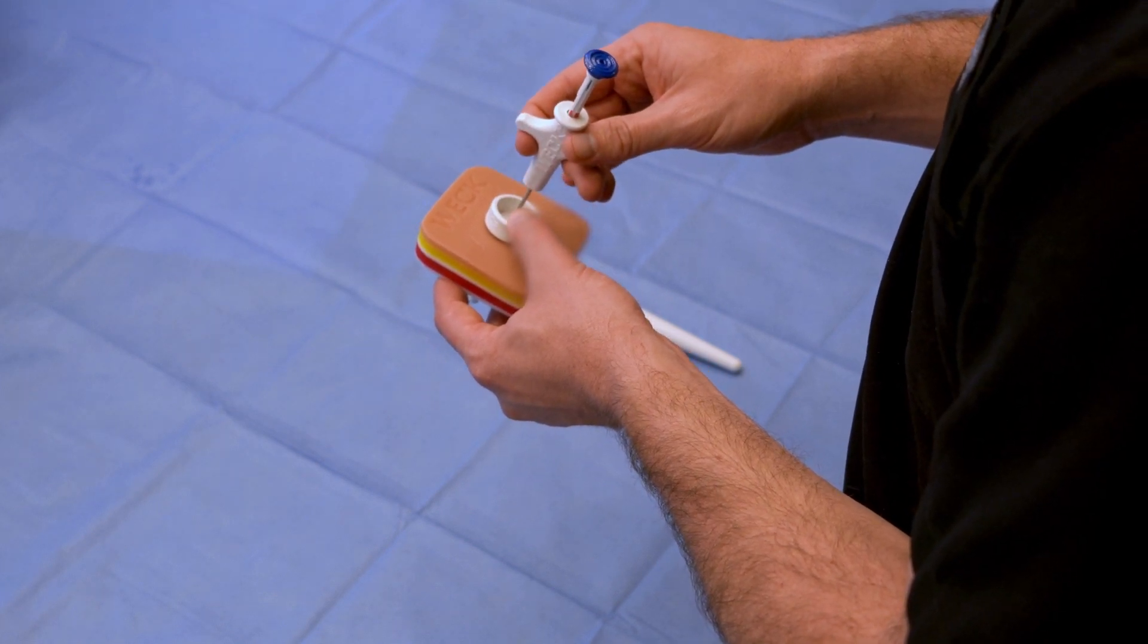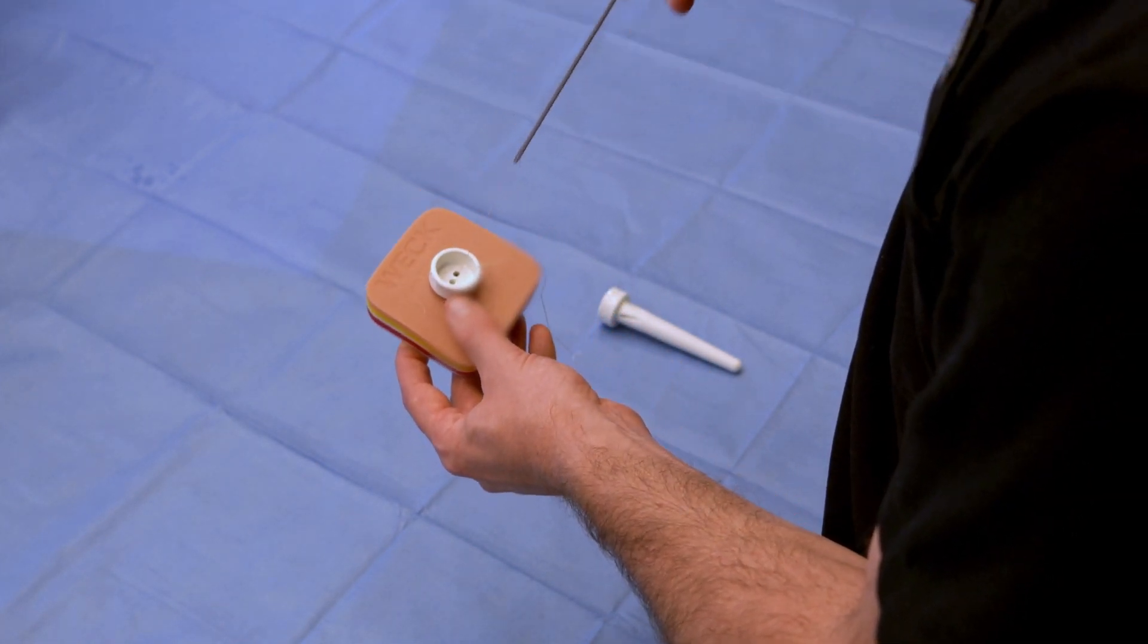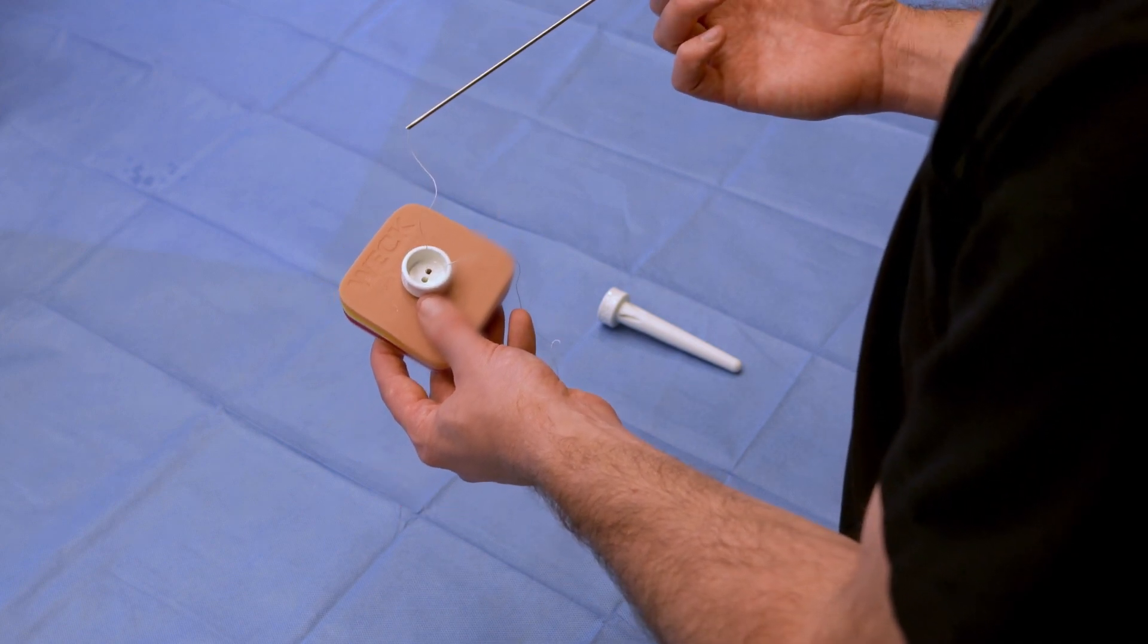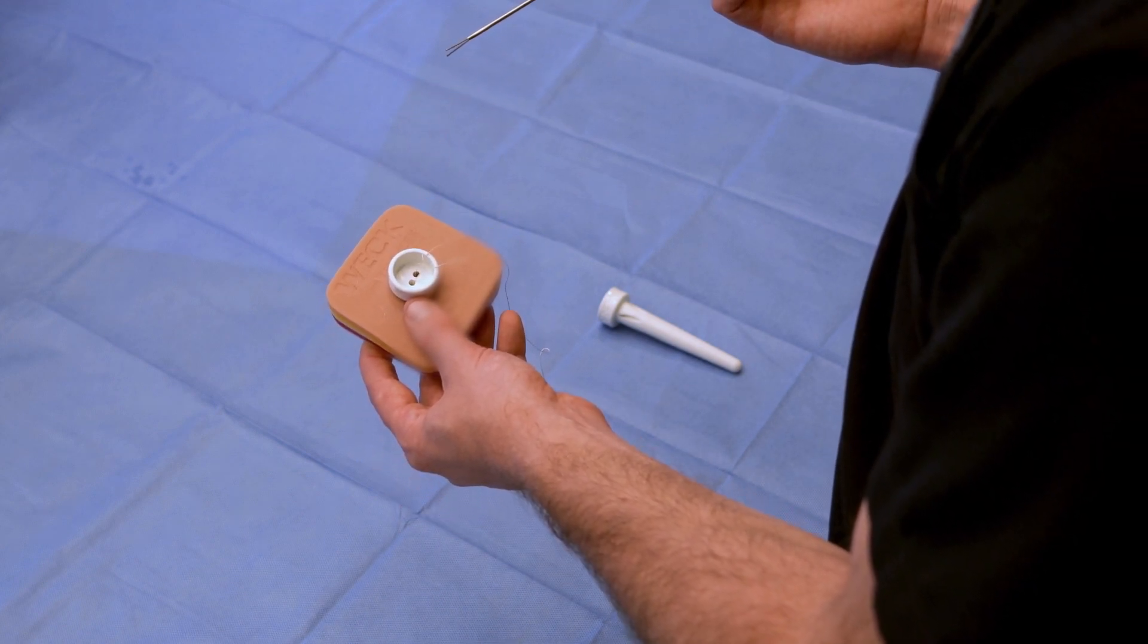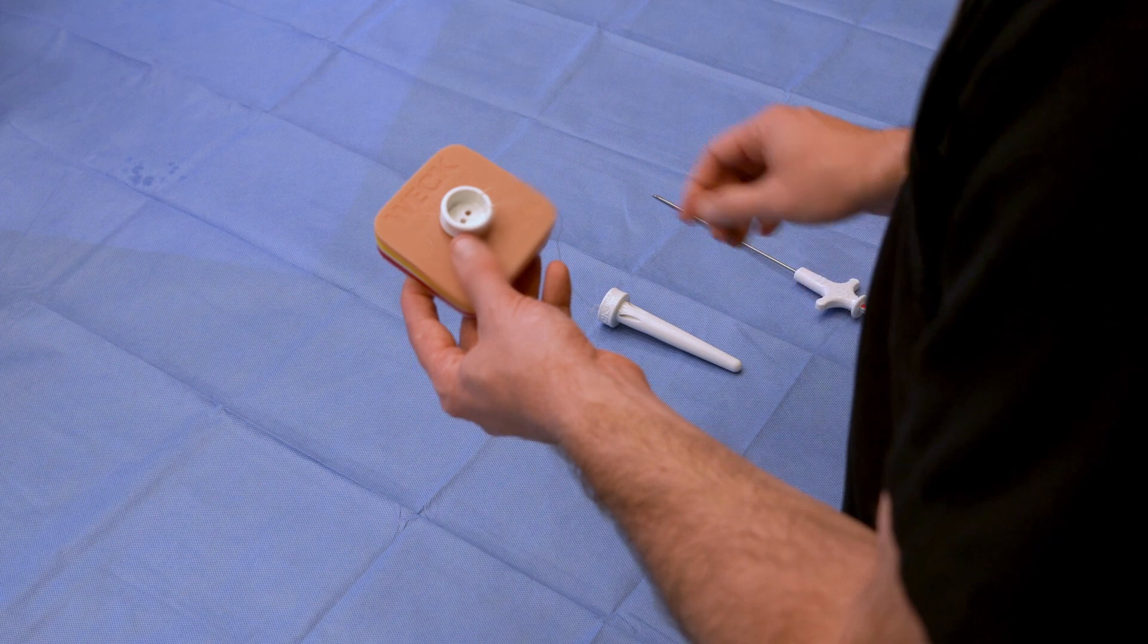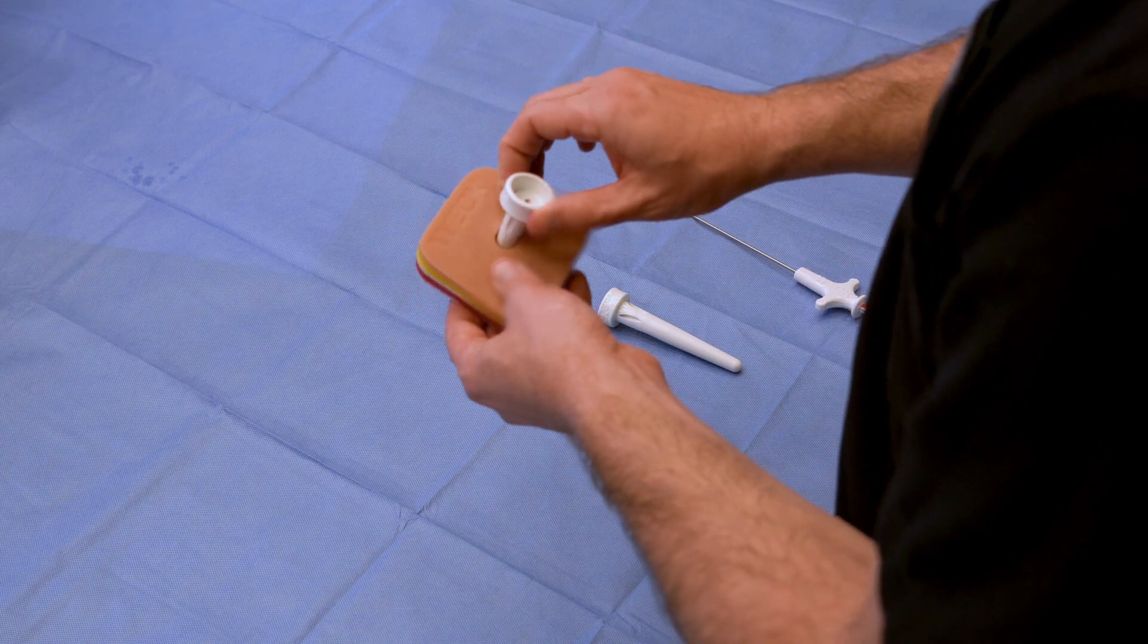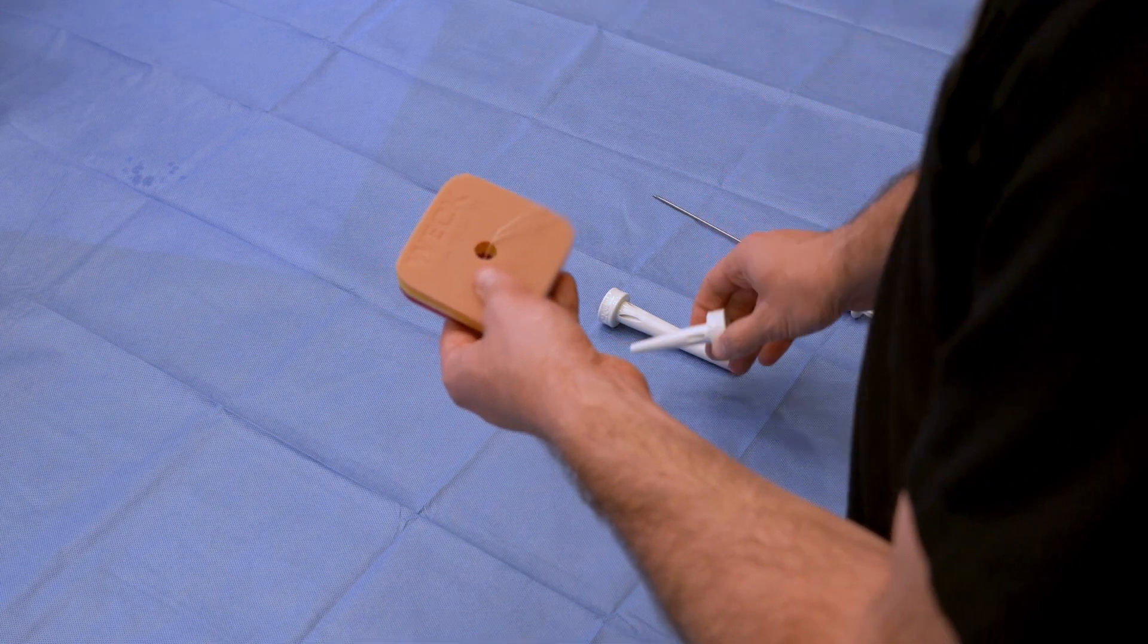Retract the suture passer through the pilot guide channel and press the button to release the suture. Once retracted, press the button one last time to release suture. Remove the pilot guide channel.